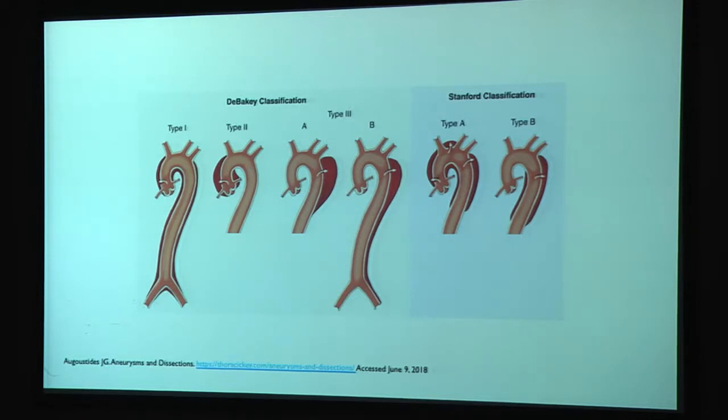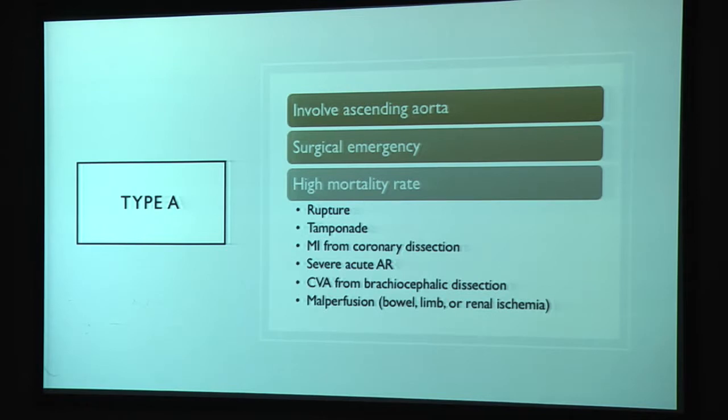Those were trying to really have a better functional definition, but I think why these have stuck is because they're so easy to remember, and sometimes we get too complicated with classifications and nobody ever really adopts them. I think ease of remembering and ease of adoption tends to be key with some of these systems, as we've seen in how we evaluate the aortic valve or the mitral valve. The more complicated methods tend to be ones that aren't used as often.